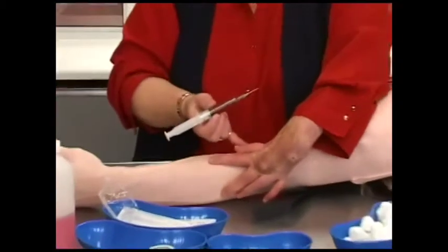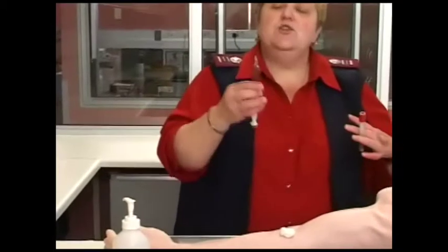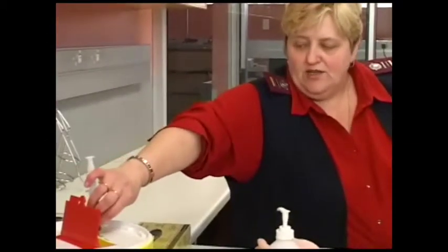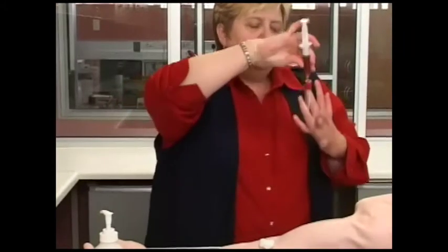Ask the patient to press down on the site. There are two ways to transfer the blood. You can put on a new needle, discarding the first one in your waste bin, and then insert the needle into the tube. Because the tube has a vacuum, it will suck in the blood by itself at the correct speed.